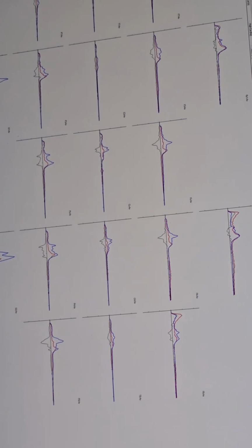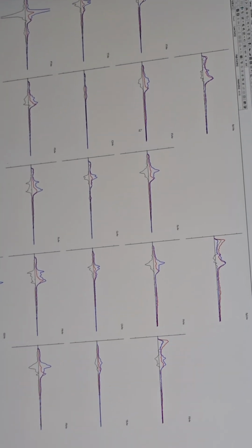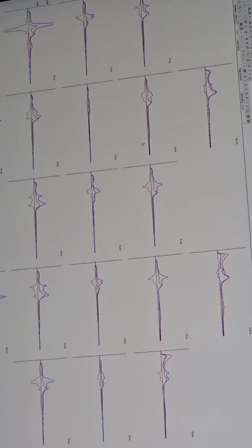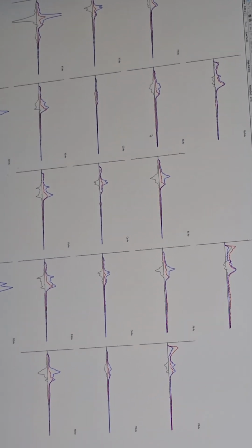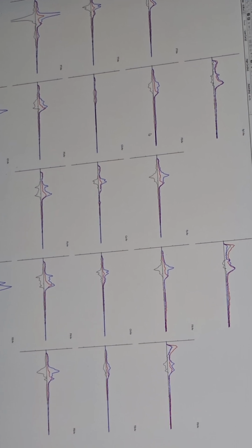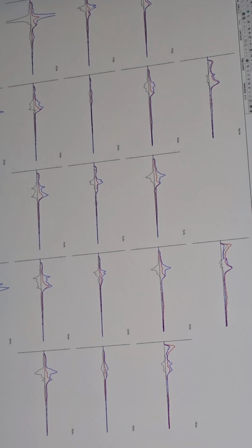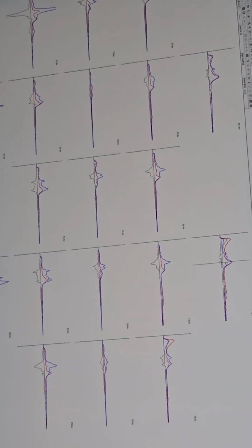Coming back to this, I'm really surprised to see that much of a change after just 5 days. What I'm not detecting from you, though, is any self-report of things feeling different. When I see this kind of alpha, it hasn't really changed much up here.